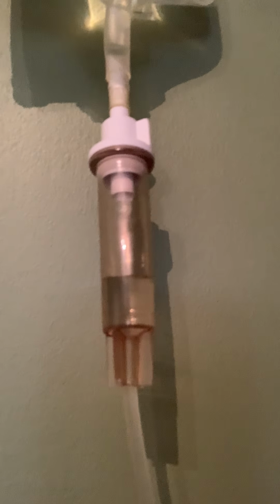Now that everything is set up, I will perform my system assessment. I'm going to start by double checking that I've administered the correct solution, which was normal saline, 0.9% sodium chloride. I'm going to make sure I have the right tubing, and check the drip chamber, making sure that it was filled up to the drip line and that the infusion rate is correct.